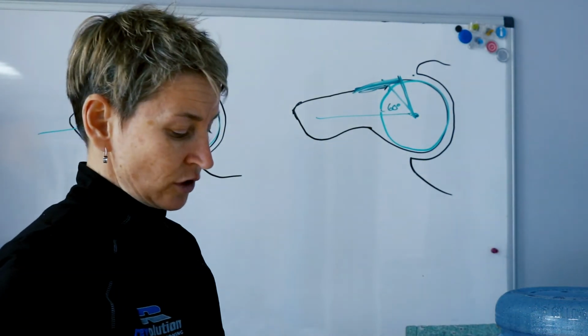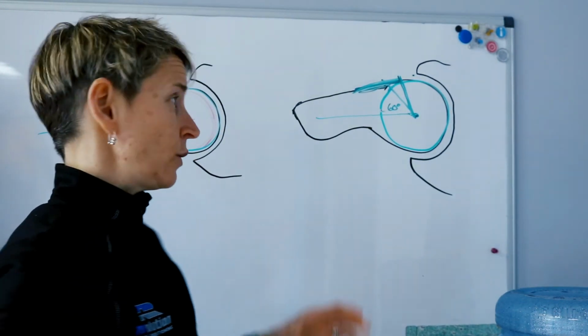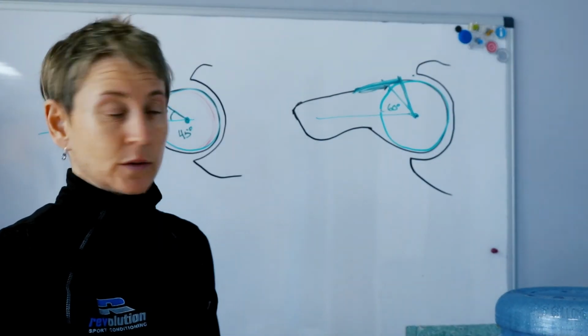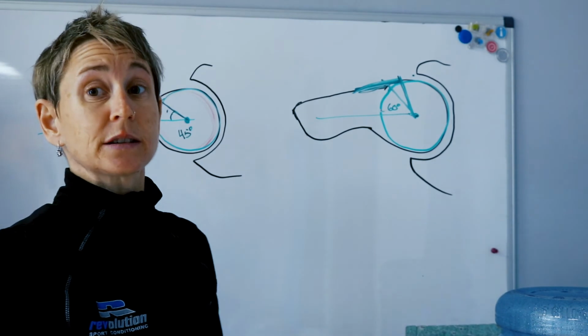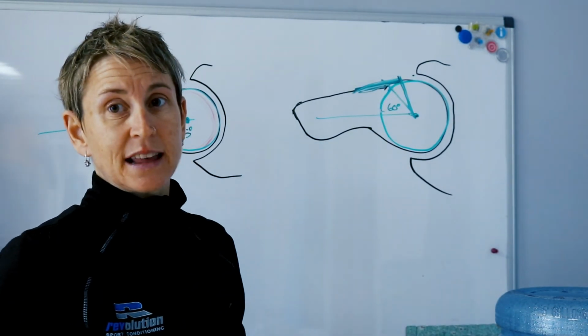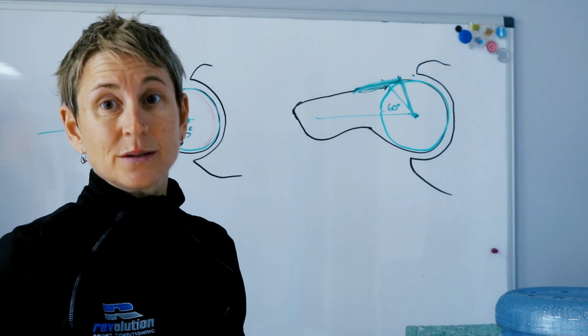So that's how they measure. It's one of the things that they look at anyway. So if you're symptomatic and your alpha angle exceeds this threshold, then they're going to be really highly suspicious that, hey, I think it's probably this impingement that's causing that hip pain, and then they might want to go and do something about it.